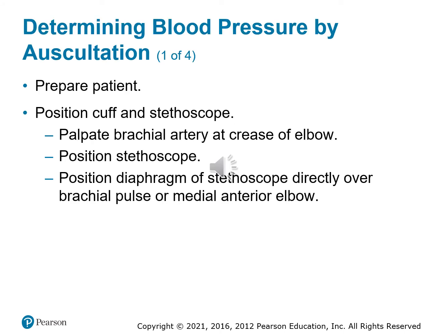So first and foremost, prepare the patient. Again, don't do anything without the patient's approval. If you physically touch the patient and they didn't want you to, it could be considered assault, so make sure you're explaining to the patient what you're doing as you're doing things, and then you want to get that blood pressure cuff into position.